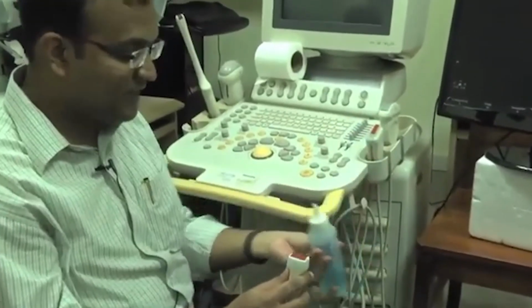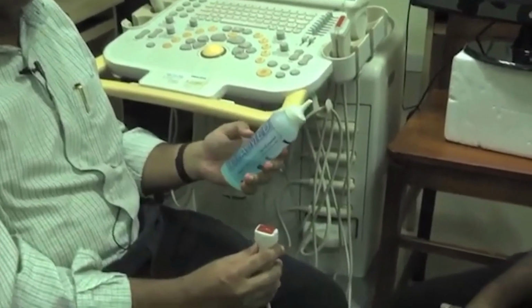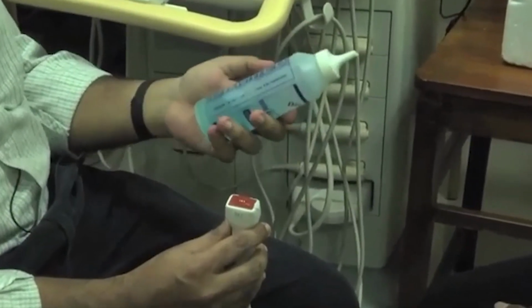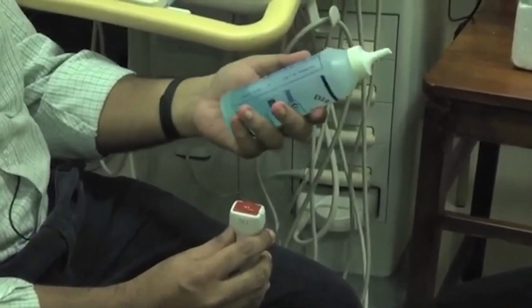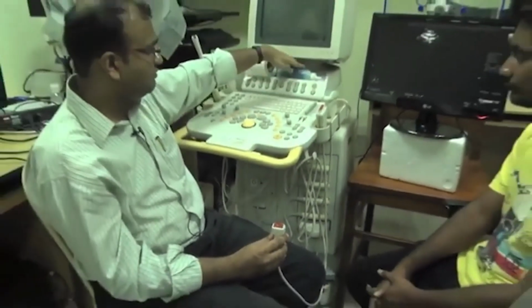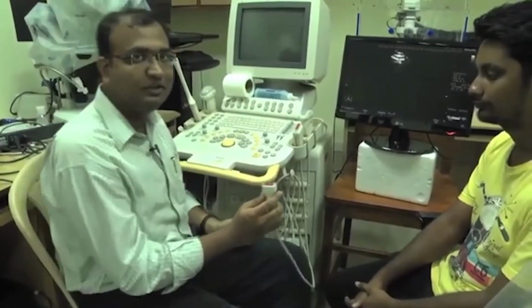Now you can see as I put up this gel, which is basically just a sonologically conductive gel. It is nothing other than some gelatin and water and some preservatives mixed together, and it's perfectly non-toxic for external use, although it's never suggested that you try eating it because it's not an edible product as such.